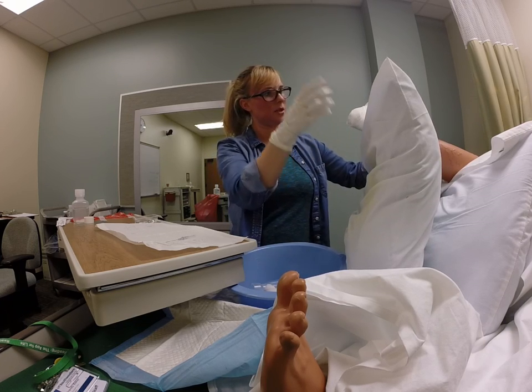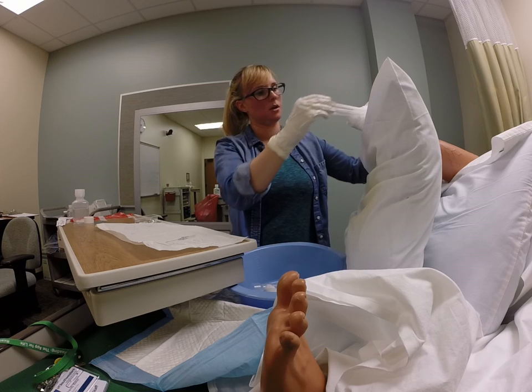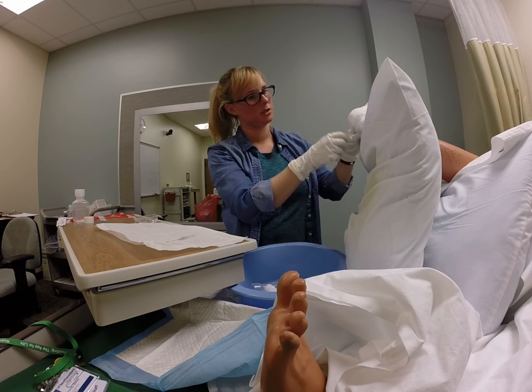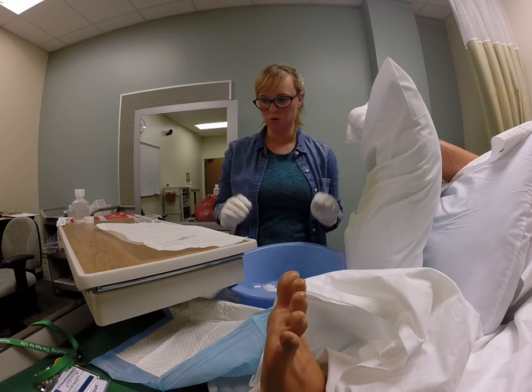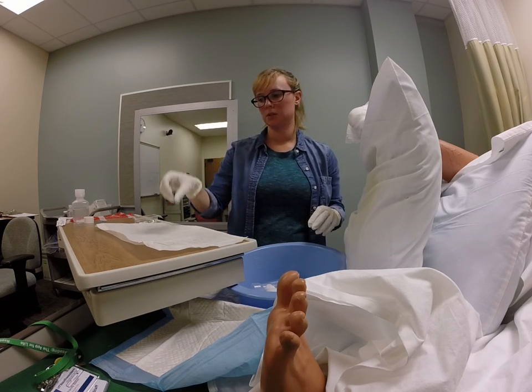Once I get this wrapped in tape, just one piece of tape at the end. Preferably the tape needs to be on top of the foot, because if they get up and ambulate with this, you don't want it coming undone because you put your tape on the bottom. Date, time, and initial. I'm going to throw this in sharps, and you're done.